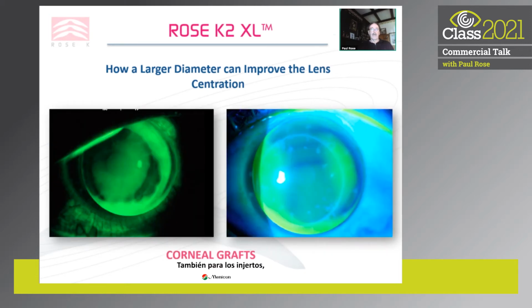Also for grafts, a corneal lens will always center towards the highest point on the cornea. So if the highest point is along the graft-host interface, which is so often the case, the lens will decenter out, as you see here, to this point. This will impact into the limbus, make the lens less comfortable, and make it more unstable. You can see here it's lifting off. So in grafts, again, if you have these high areas and you have decentration problems, XL would be my choice if you can't resolve it with a corneal lens.